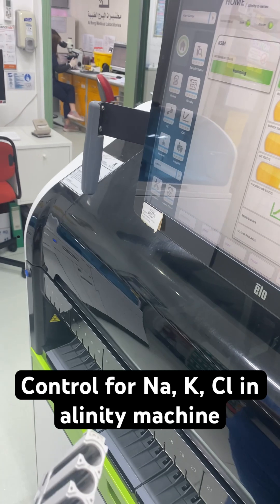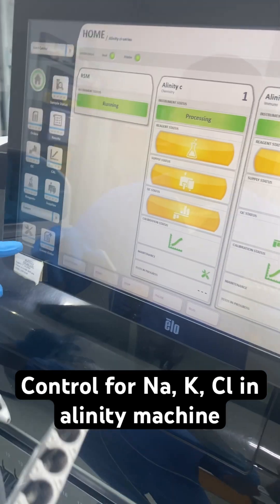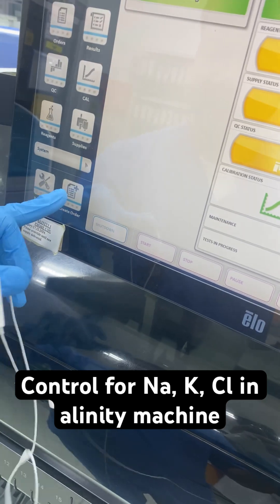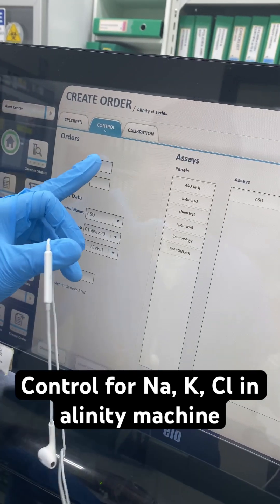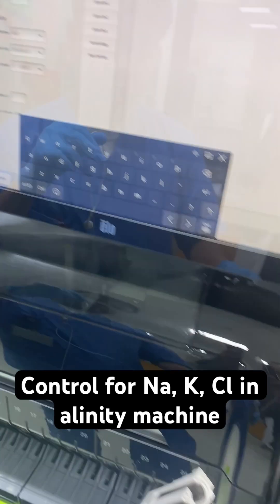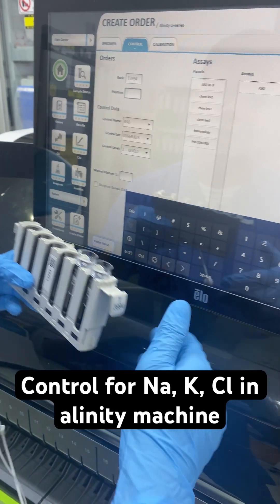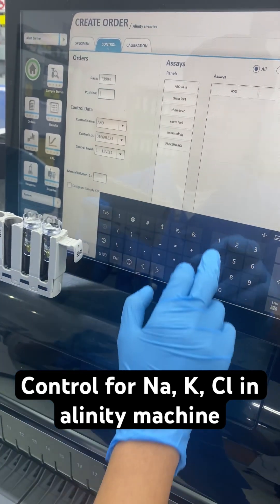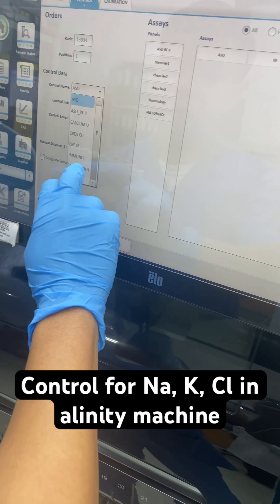Now we are going to order the controls. Click on Create Order, then click on Control, click on Rack, scan the rack, set the position starting from the right, and select your control — TechnoPath.